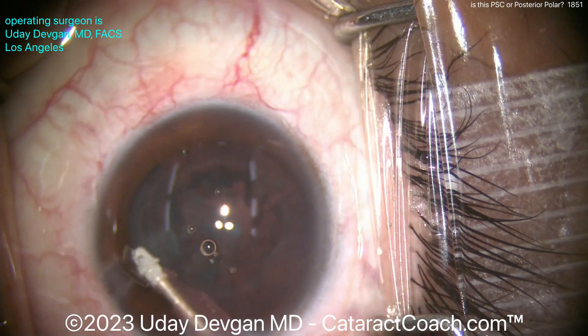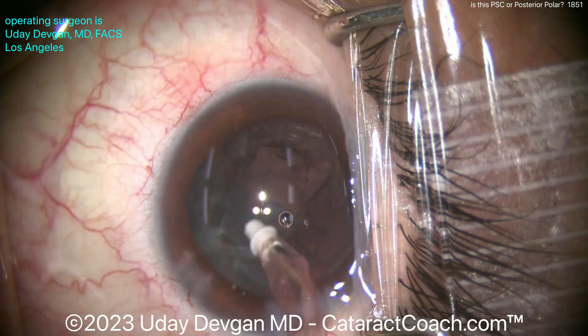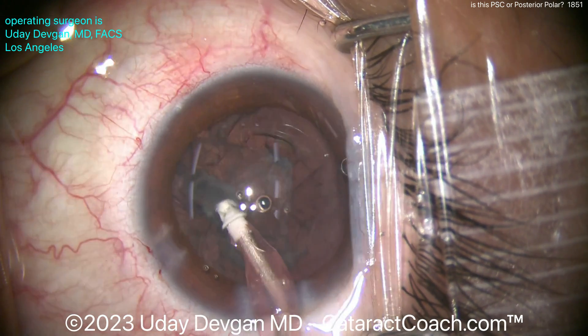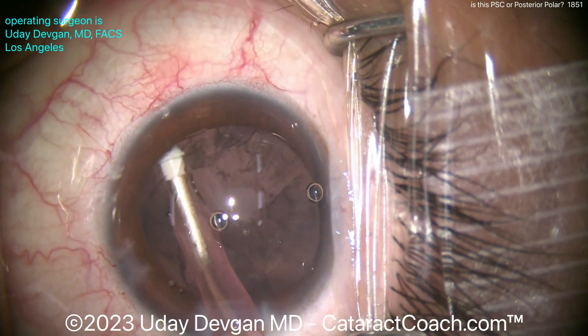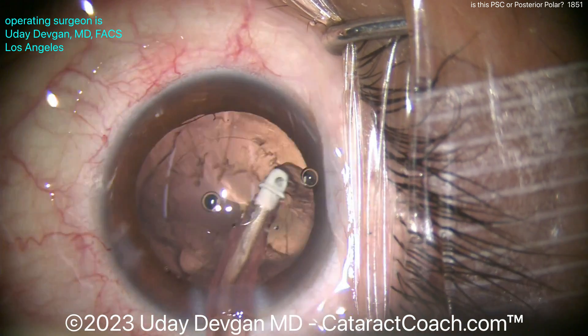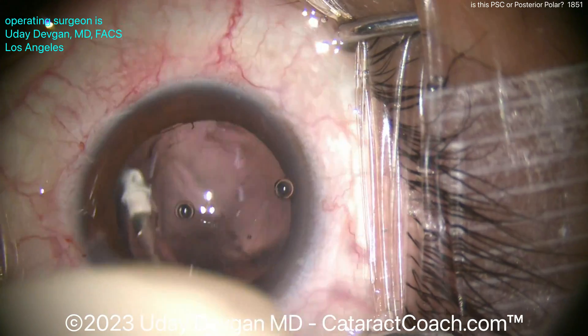Now let's go in with the IA probe and clean up. Clean up most of the peripheral stuff first, and then obviously don't touch the posterior capsule centrally — just wait. We did not do a hydrodissection, so we've got to spend a little more time getting out that cortex that's a little more adherent to the capsule. Going around again, taking these pieces out — looks pretty reasonable. I think we escaped.